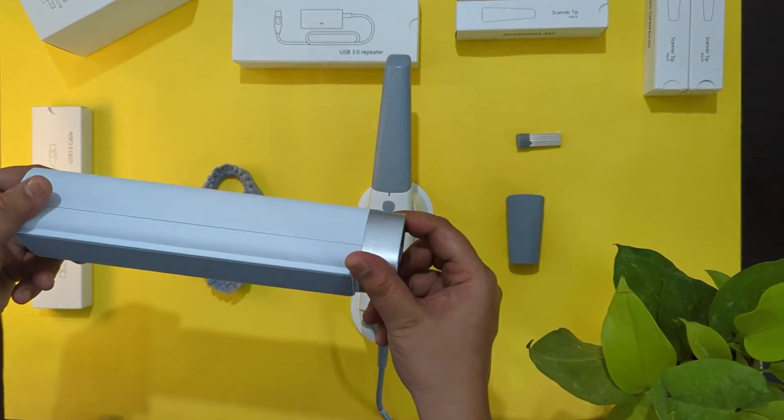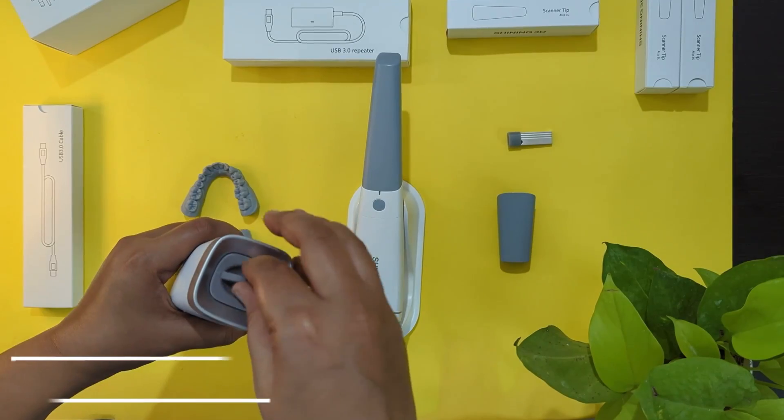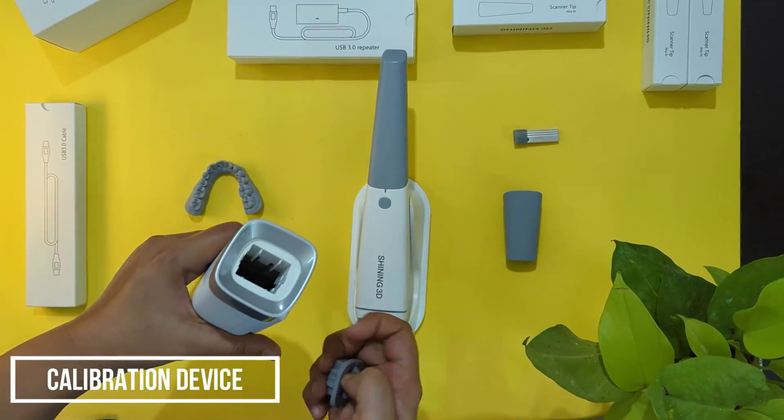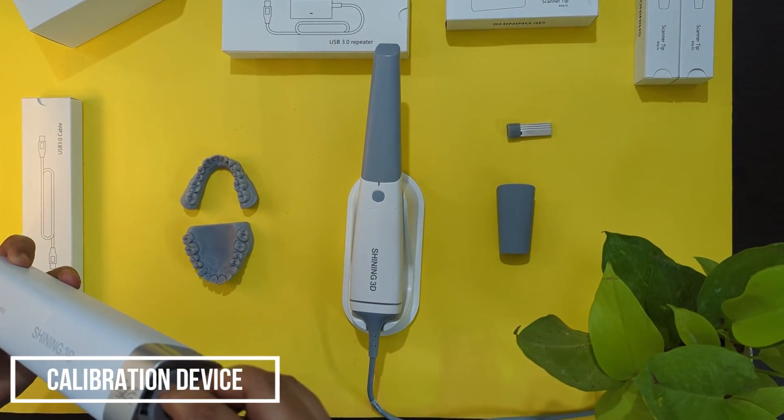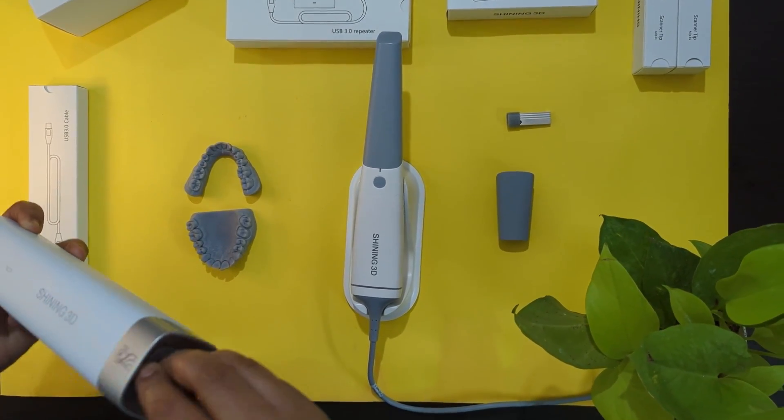We also have a calibration device. We put the scanner inside it and calibrate regularly — once or twice a week depending on usage.